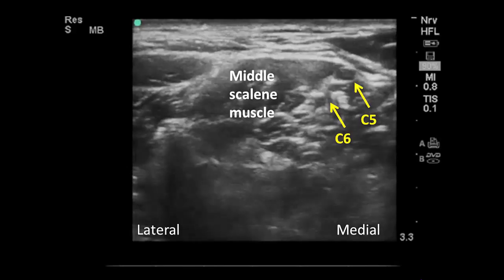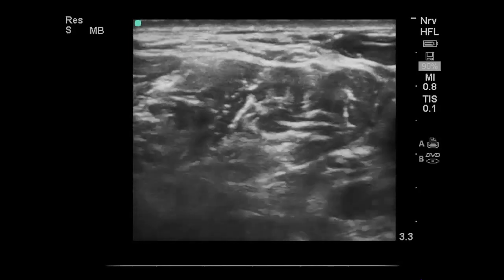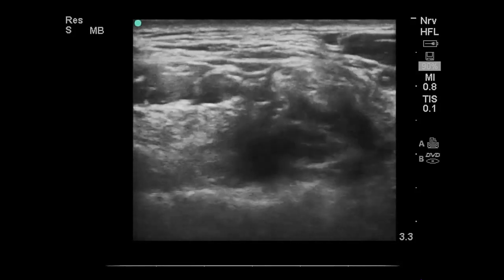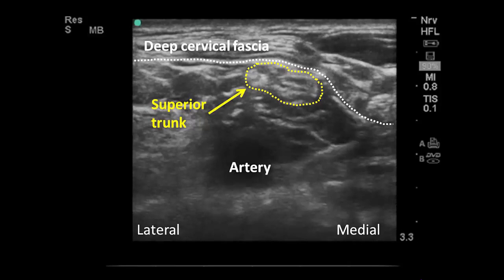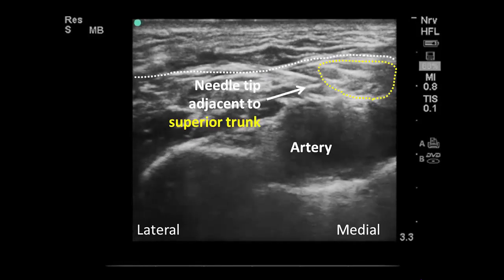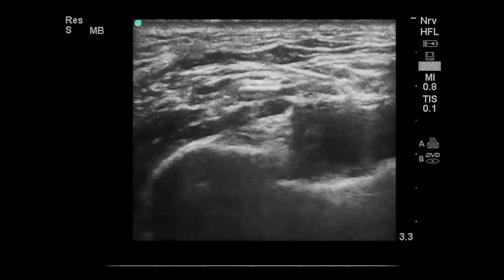In this final example, the C5 and C6 roots are shown coalescing into the superior trunk. As in previous examples, the needle is inserted under the deep cervical fascia, and injection next to the superior trunk produces appropriate spread around it.